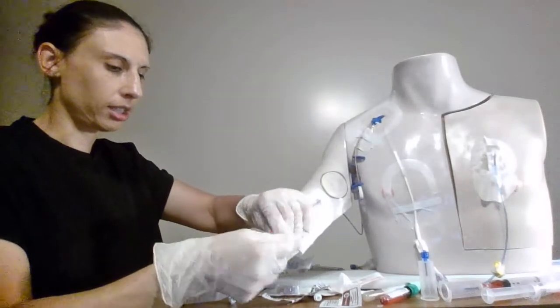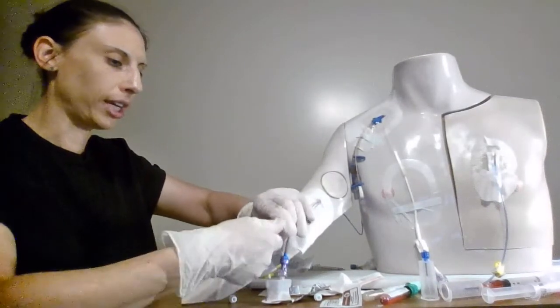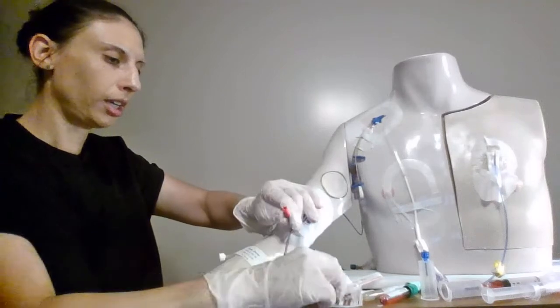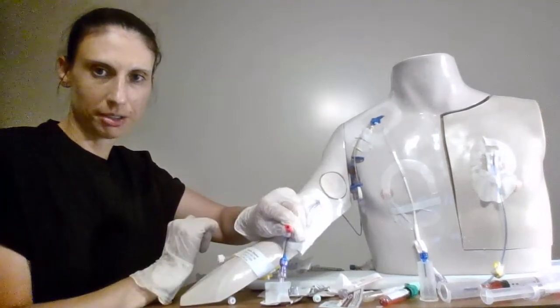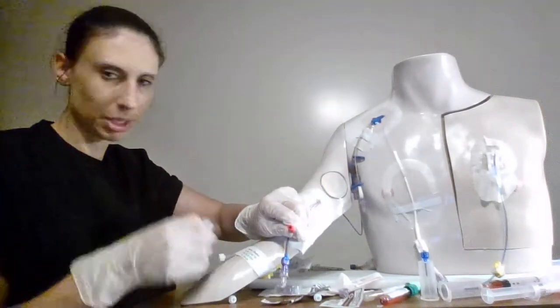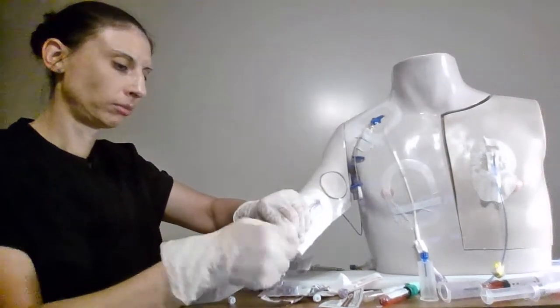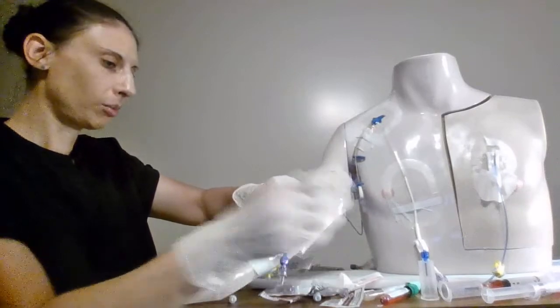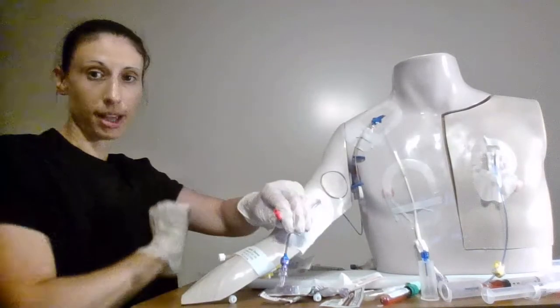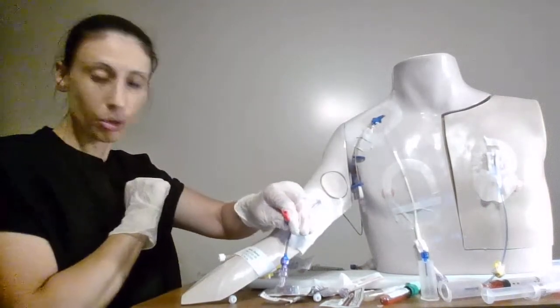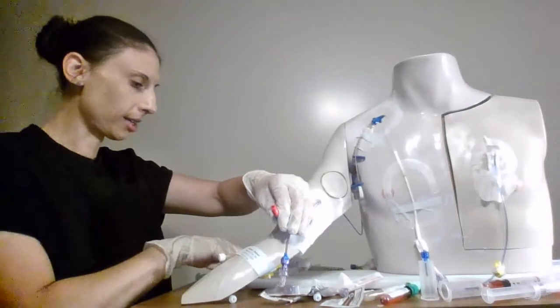All right. So once it's nice and clean we're going to unscrew that cap. If we notice that the lumen here looks a little bit contaminated or there's blood or medication or something we can definitely swab that as well. And we don't have to worry about any clamps because the valves inside are closed. So nothing's going in. Nothing's come back.